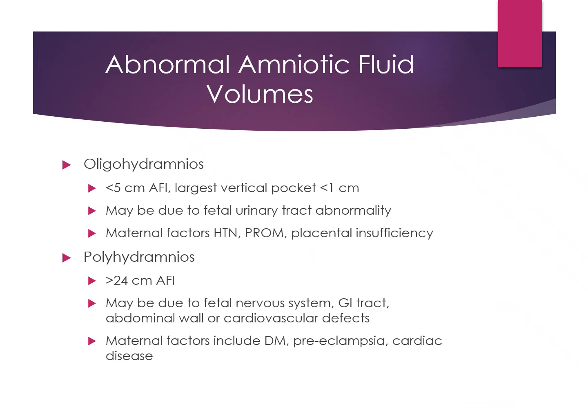And we measure this because there is such a thing as too much fluid or too little fluid. And we have very good names for them, okay? We have oligohydramnios, which means too little fluid. This means that in any of the 4 quadrants that we added together, if it is less than 5 centimeters in measurement, then that would fall under too little fluid for that baby.